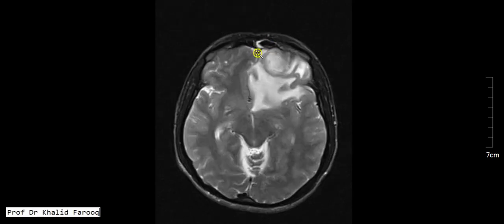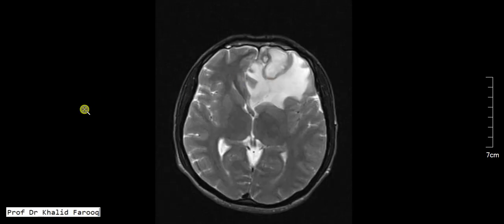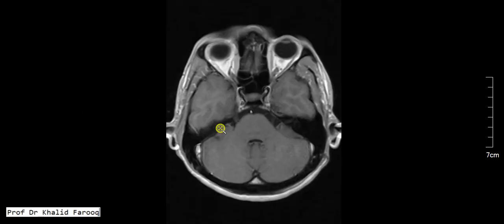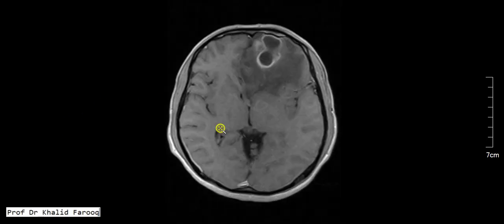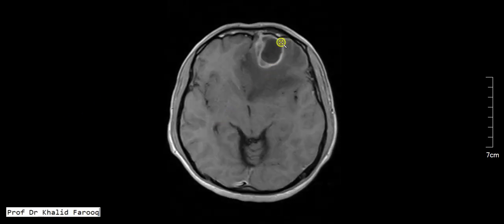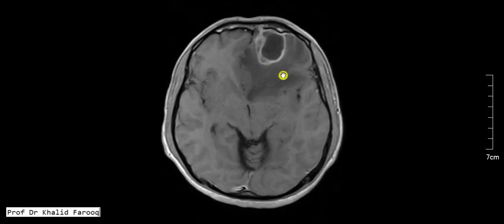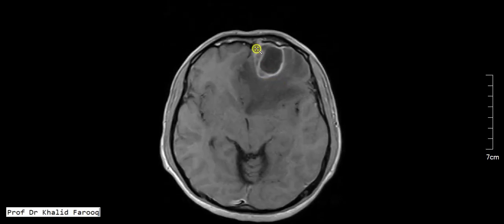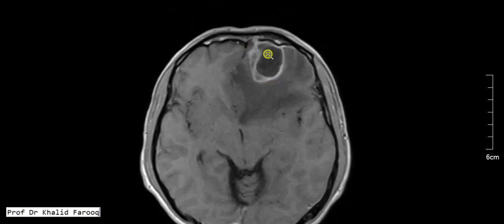There is a mild degree of sinusitis involving the left frontal sinus. On post-contrast axial images, the low signal intensity wall on T2 shows intense enhancement on post-contrast images.